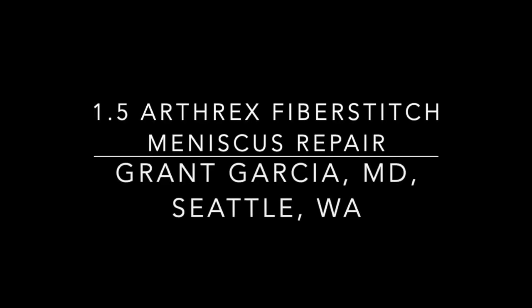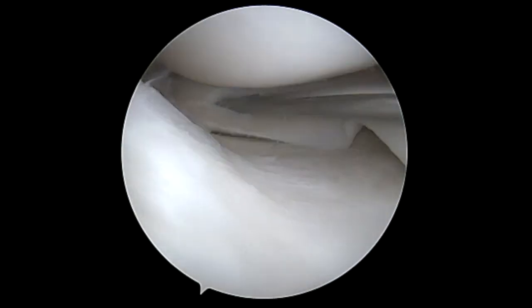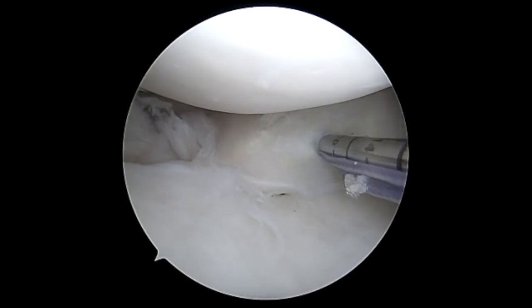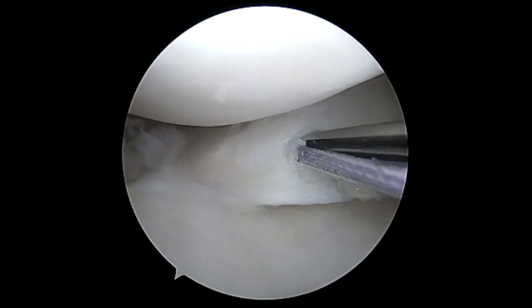Today we're going to demonstrate the new 1.5 Arthrex Fiber Stitch, using this for a vertical tear of the medial meniscus. We're going to use a ball rasp to irritate the tear and prepare it for fixation. You can see you have a much smaller needle, so less tissue penetration — you can fix tears that are closer to the periphery.